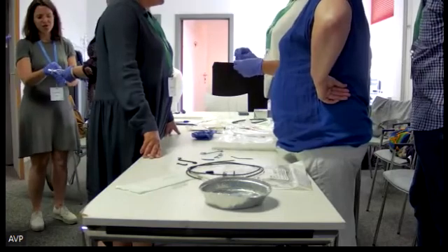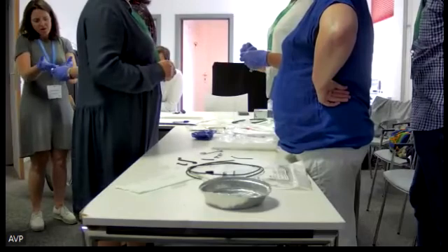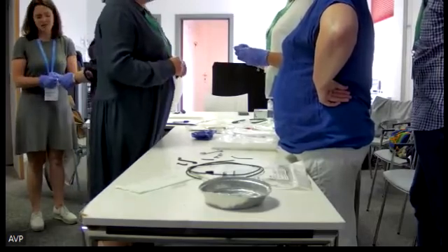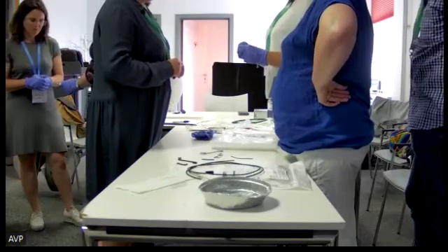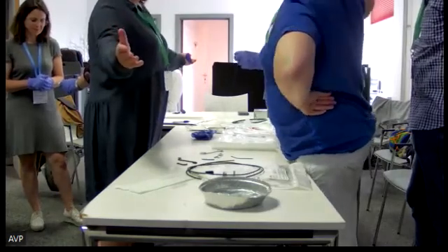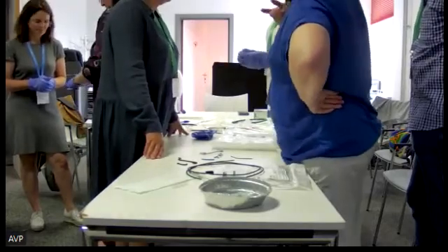For the pneumologist it's shorter. For the standard punctures, we use 20. For the lung, we use 5. For the gastroenterology, actually 10. Yeah, 8, 10.